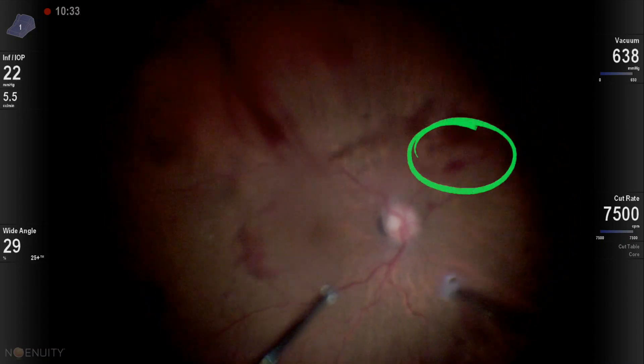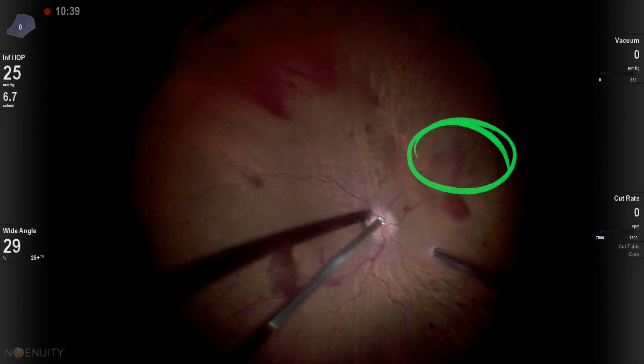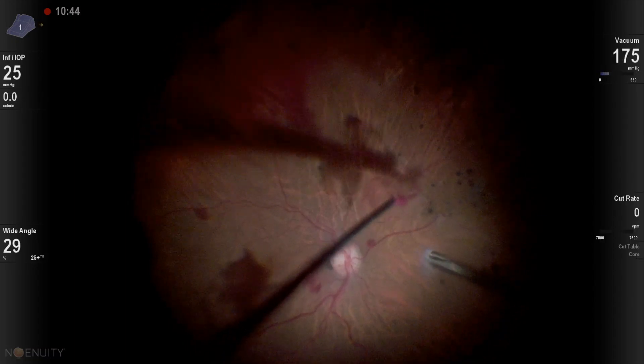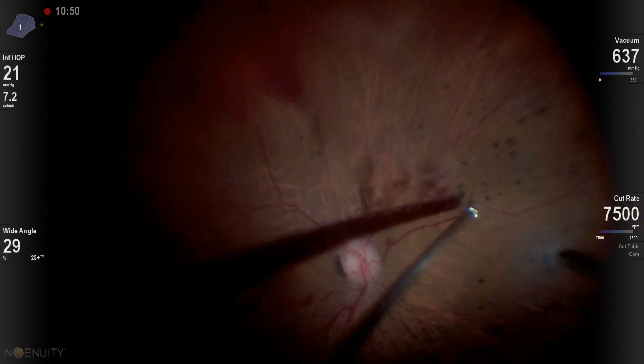I start by really looking around and looking at the areas of traction — as you can see here highlighted in green — that I know I should not pull in. Then I start with a little bit of a pull to get things moving, and after that I cut very deep to separate the vitreous from the epicenters.